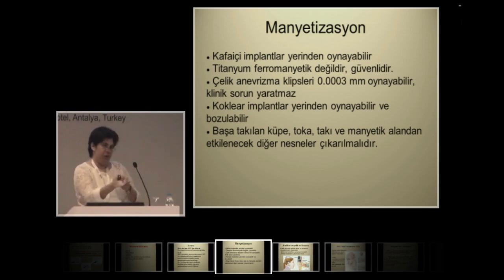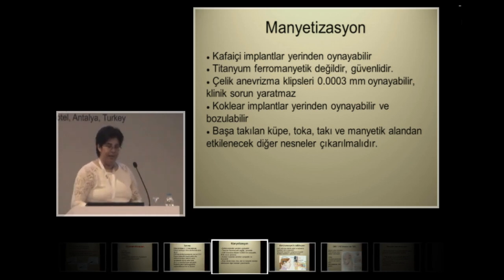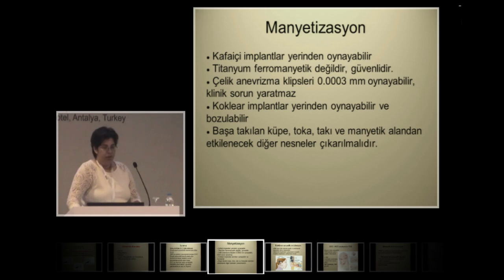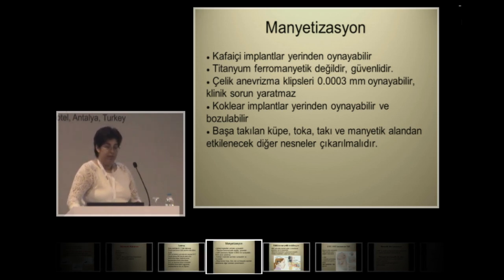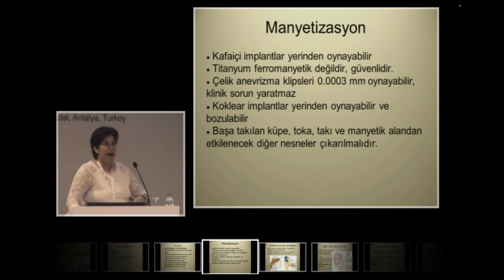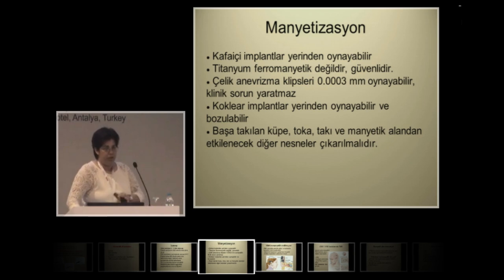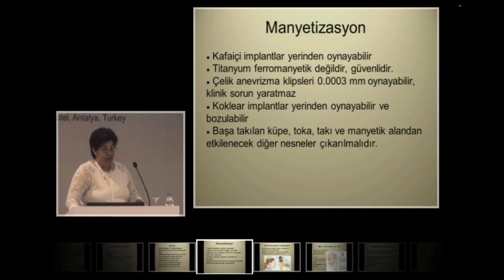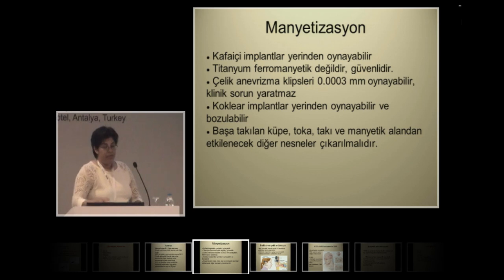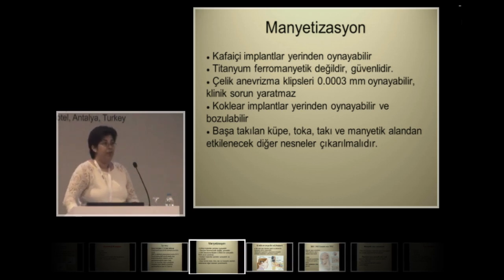At the end of the day, the magnetic field is induced, and some metals are sensitive to magnetism, and they can be dislocated. If there's a metal object in the patient's brain which is magnetic, it may be moved. So there is a similar risk to the MRI scans. For titanium, there is no risk, and most of those implants are made of titanium. Steel could be risky.